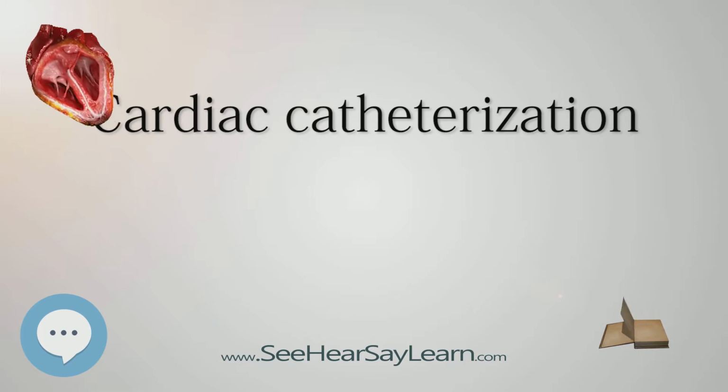Right heart catheterization, along with pulmonary function testing and other testing, should be done to confirm pulmonary hypertension prior to having vasoactive pharmacologic treatments approved and initiated. Investigative techniques used with coronary catheterization. To measure intracardiac and intravascular blood pressures. To take tissue samples for biopsy. To inject various agents for measuring blood flow in the heart, also to detect and quantify the presence of an intracardiac shunt. To inject contrast agents in order to study the shape of the heart vessels and chambers and how they change as the heart beats.